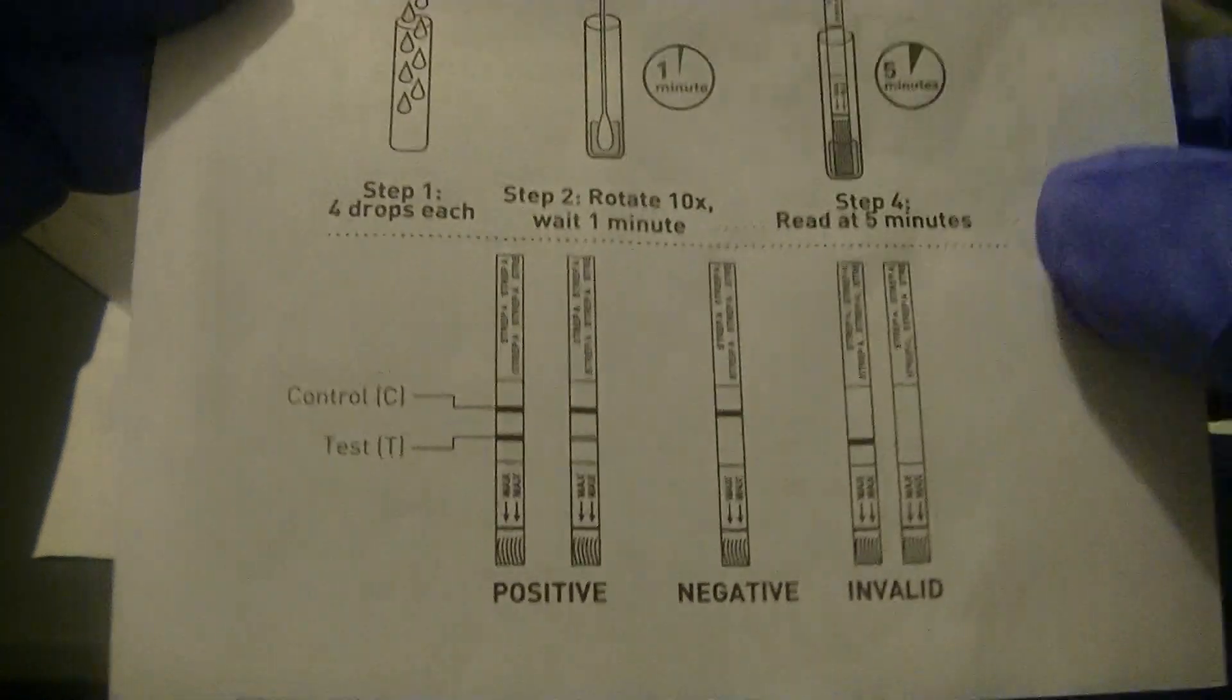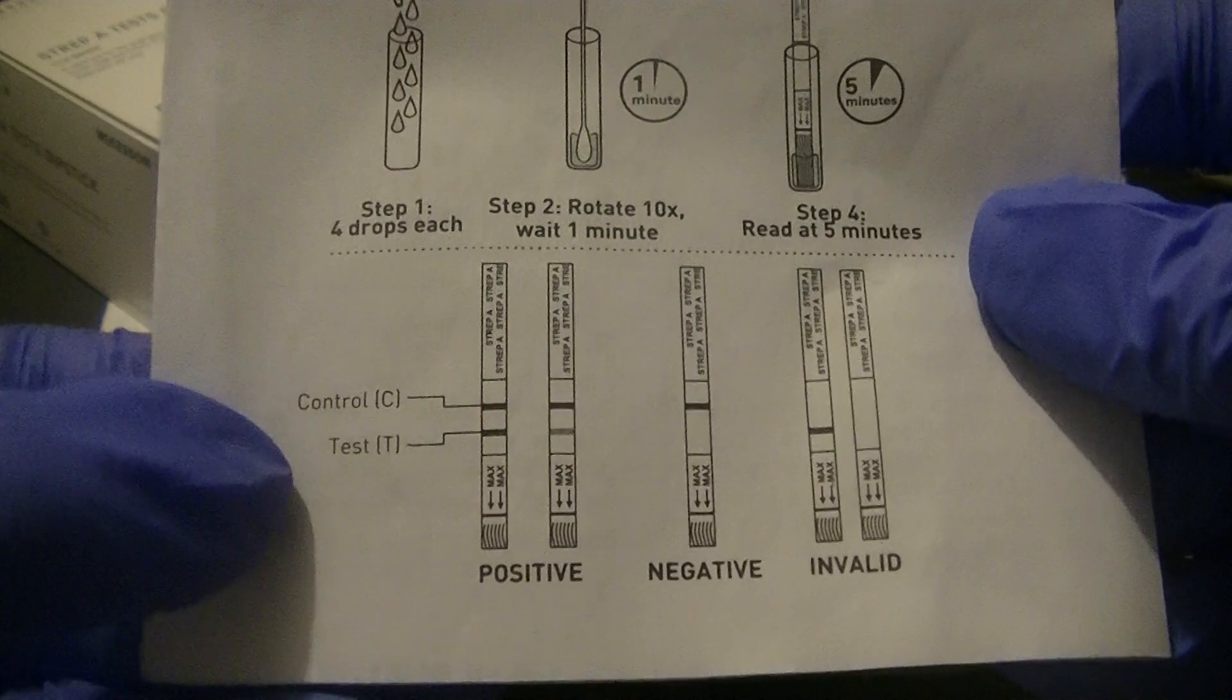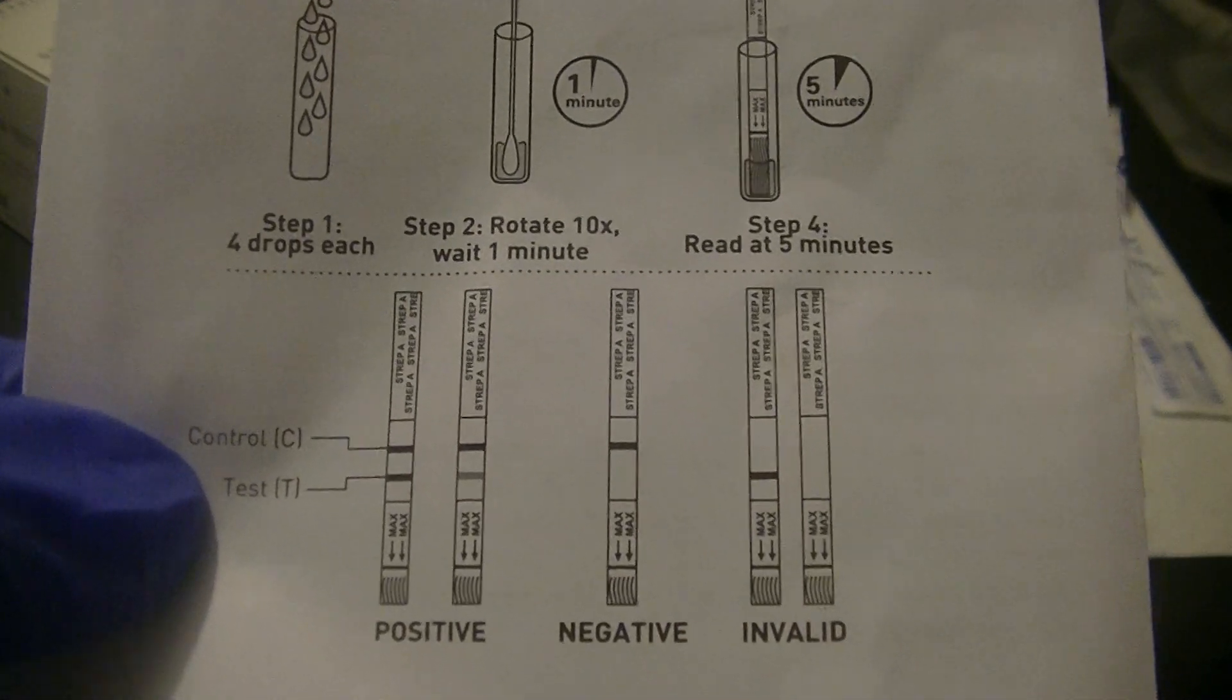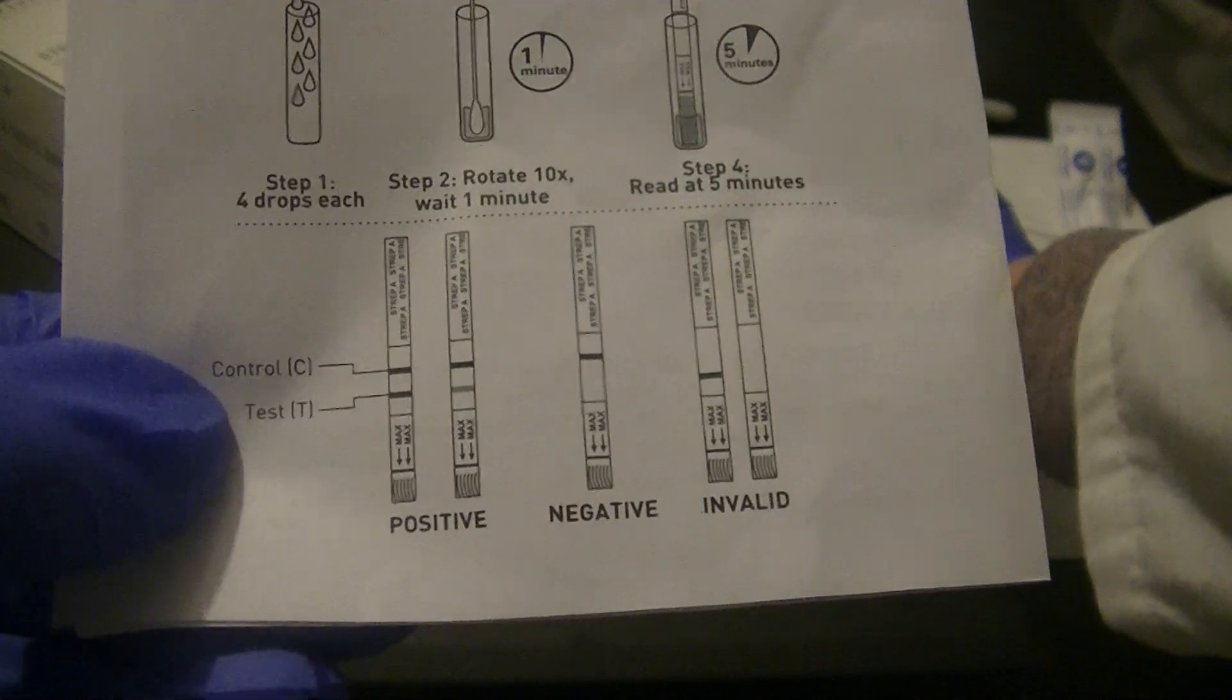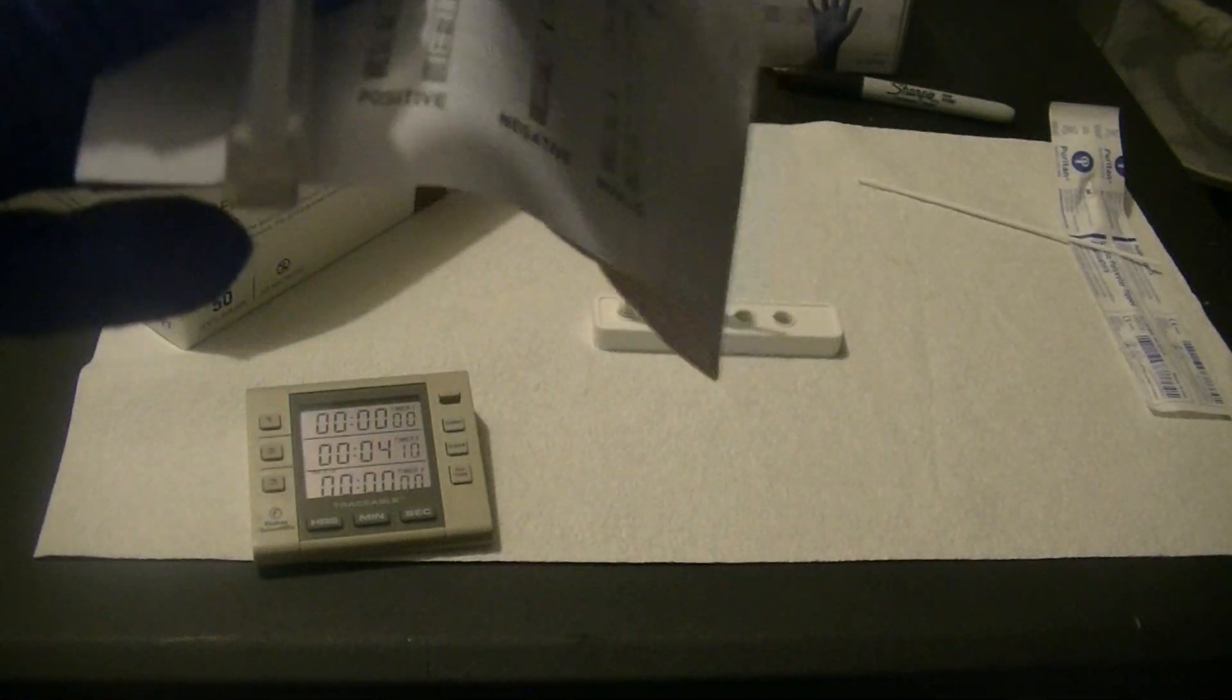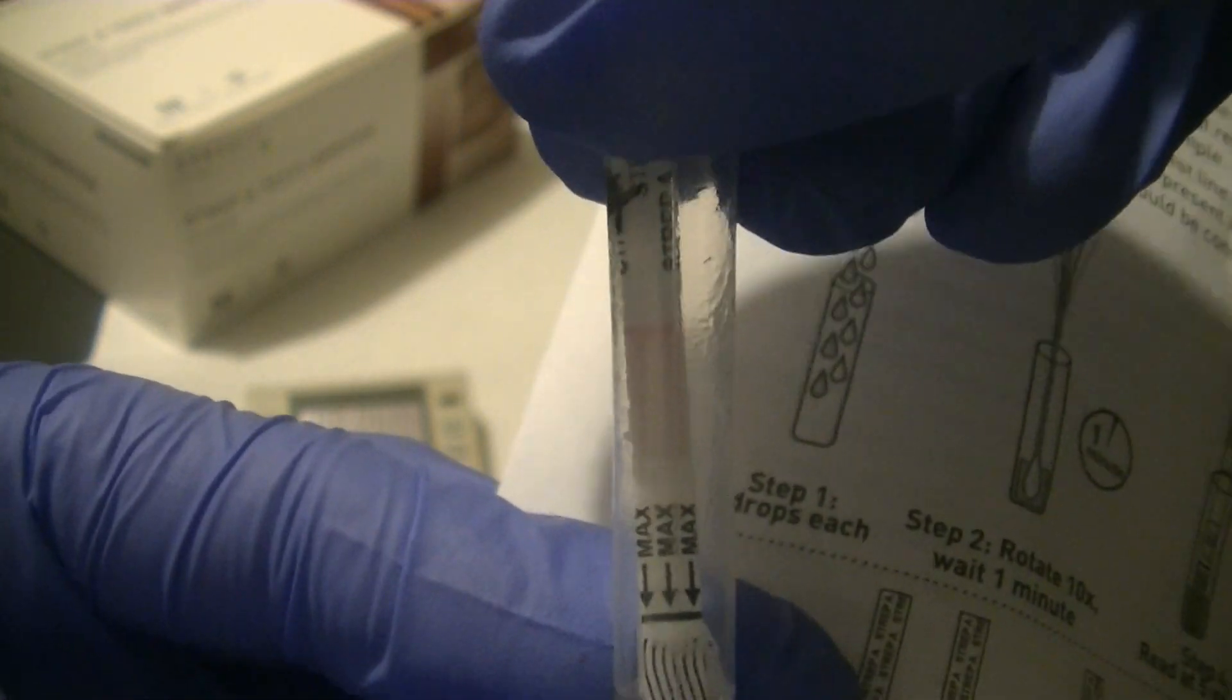If you get a control line, which is the positive line on the top of the reaction area, you can consider your test valid because the sample was able to travel all the way up through the filter paper area. I'm going to grab my patient sample and show you that it has actually already traveled all the way to the top and you can start seeing the control line already.